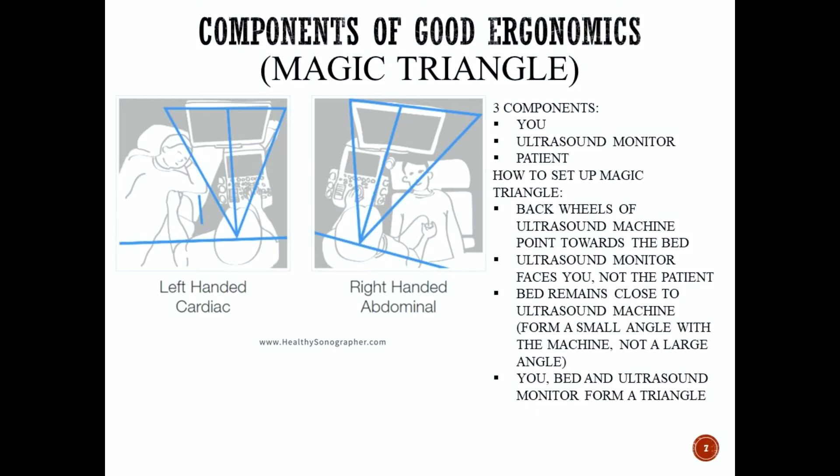You want to set up this magic triangle so that you, the bed, and the ultrasound monitor form a triangle. You set this up by angling the back wheels of the ultrasound machine and pointing those towards the bed. You want to move your ultrasound machine as close to the bed as possible, make sure your ultrasound monitor faces you and not the patient, and form a small angle with the machine and the bed, not a large angle.